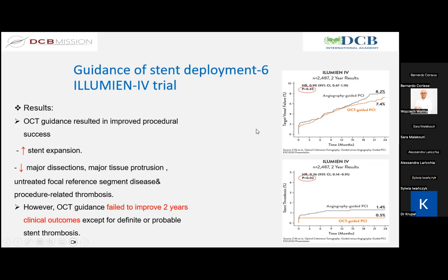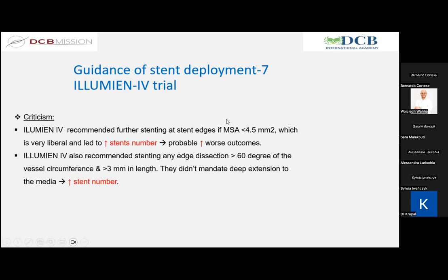It's not mandatory to use intravascular imaging in this setting, whereas in some selected cohorts of patients, yes, because other studies, on the other hand, showed an improved outcome with OCT, for example, for the management of left main, distal left main. I don't know if you will go through this data also as compared to angiographic guidance. So this can be an interpretation of the study.